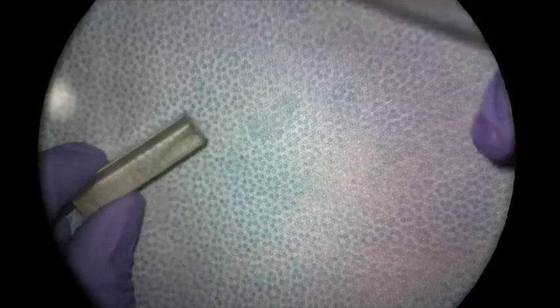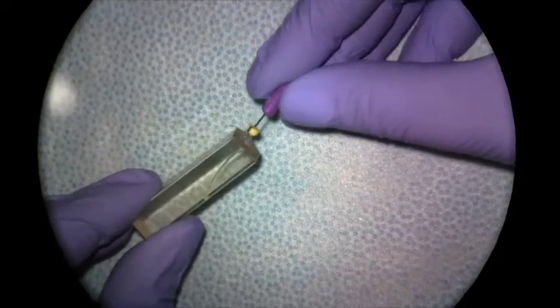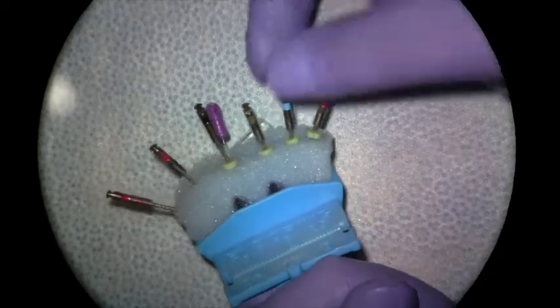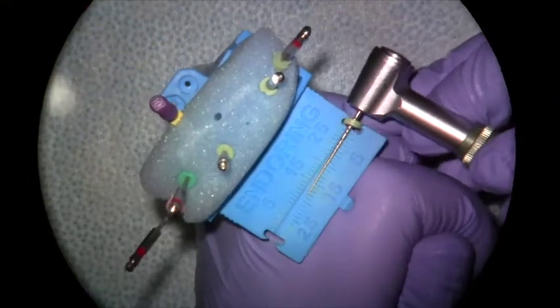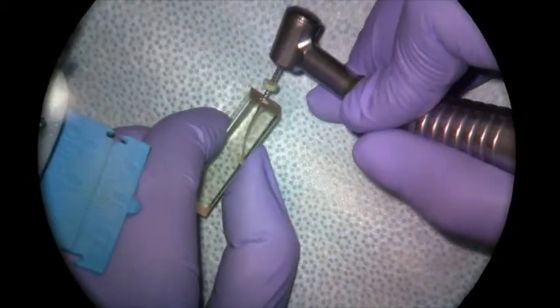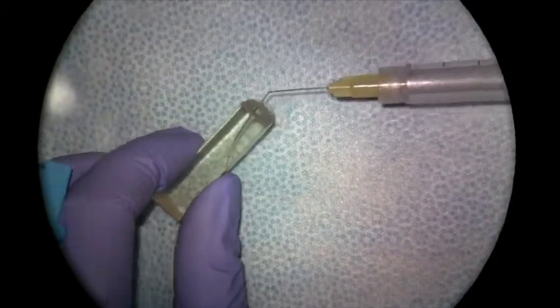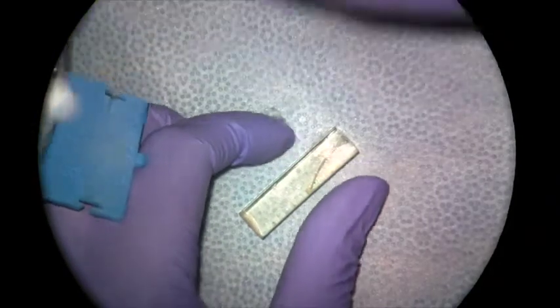I'll irrigate the canal and take my #10 file in to move any debris into suspension. Next I'll go to my 35.04, which should go a little bit deeper than the 40 but again wouldn't be expected to go all the way to working length. I'll measure it to 17, place it in the canal, and work it to resistance — this one's going a little bit further but not all the way to corrected working length. Then I'll irrigate and recapitulate before moving on to the next file.